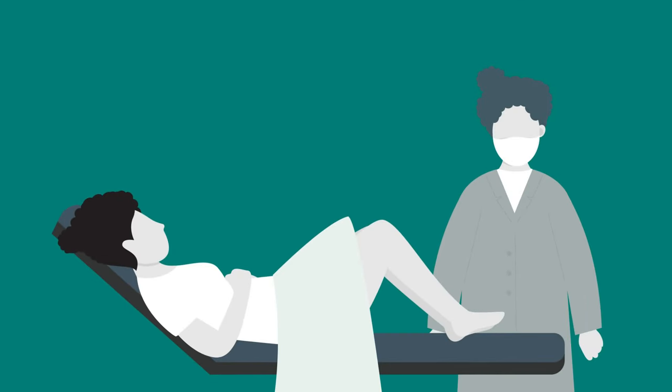Remember, you are in control and can stop the test whenever you want to. You can ask to lie in a different position or ask for a smaller speculum if the standard size is uncomfortable.